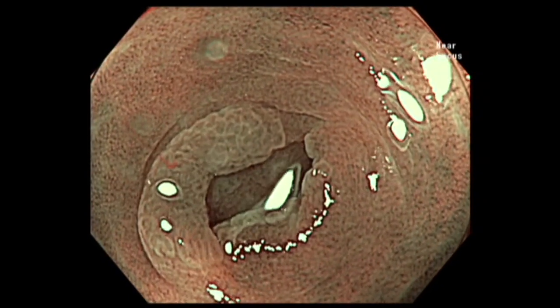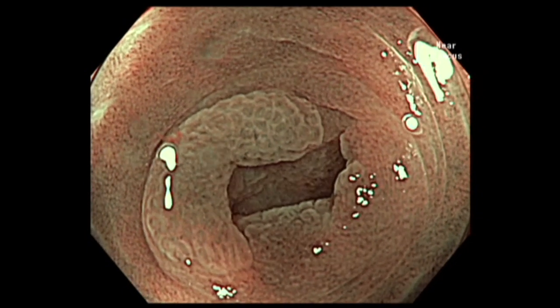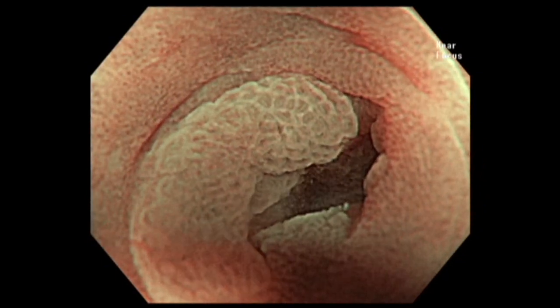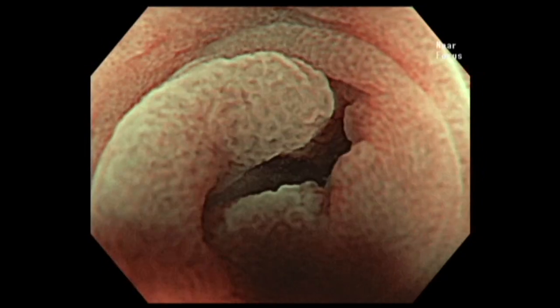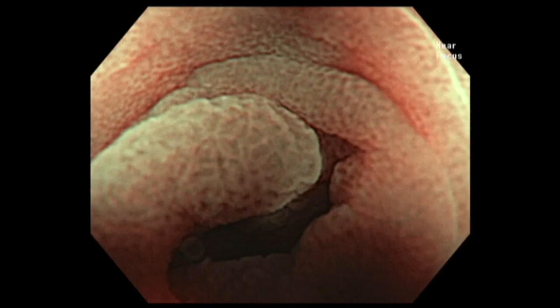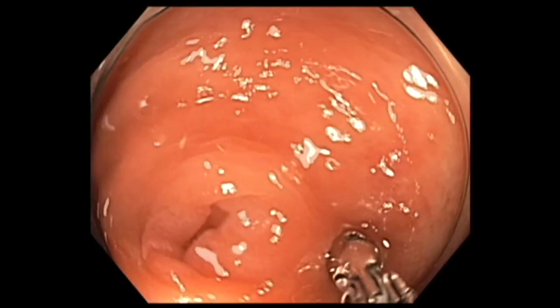We cannot define the lower margin of the sessile serrated adenoma that extended deep into the appendiceal orifice. It is important during colonoscopy to not only reach the cecum but also look into the appendiceal orifice. This is only possible if you apply a cap before you start the exam — the cap will allow you to gently open the orifice and examine it carefully.